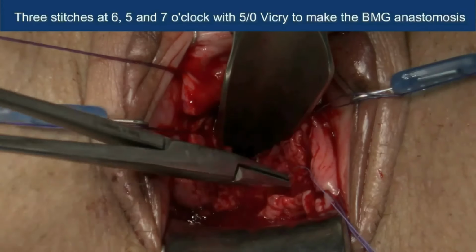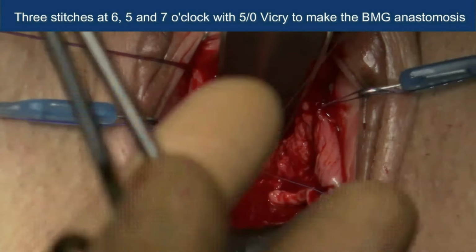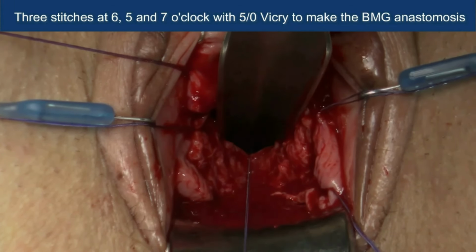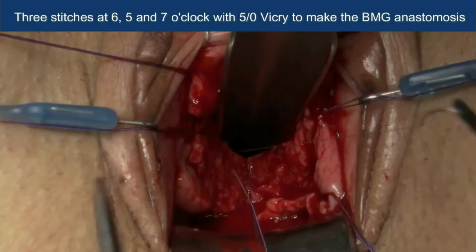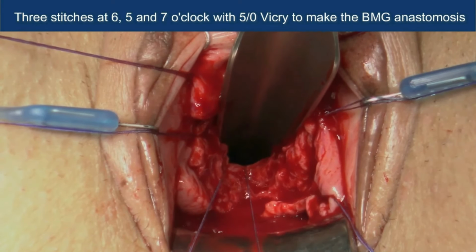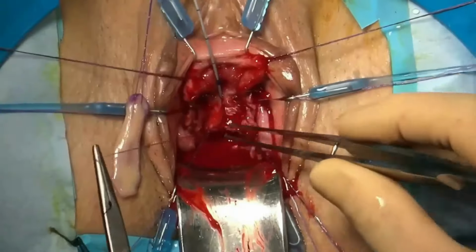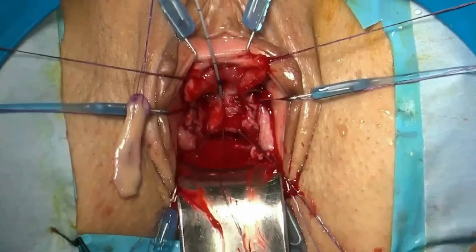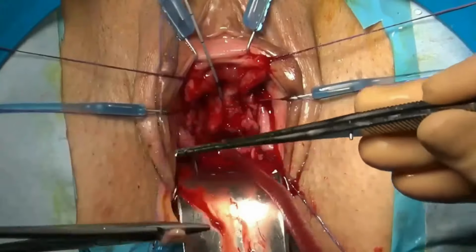Three stitches in 5-0 polyglactin suture are made for the future buccal mucosa anastomosis. Buccal mucosa anastomosis.